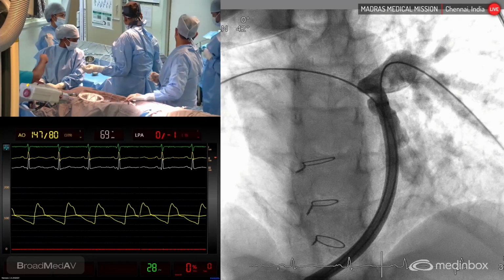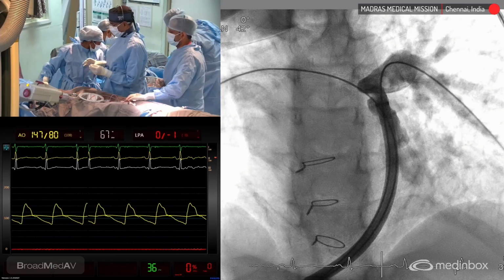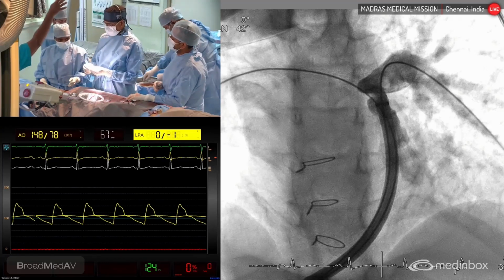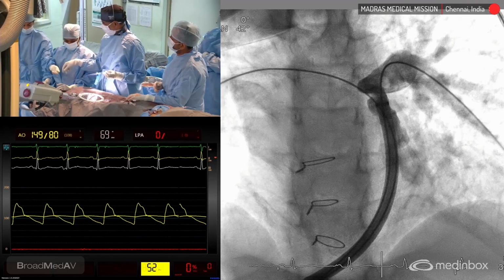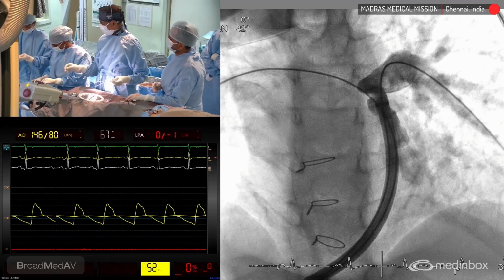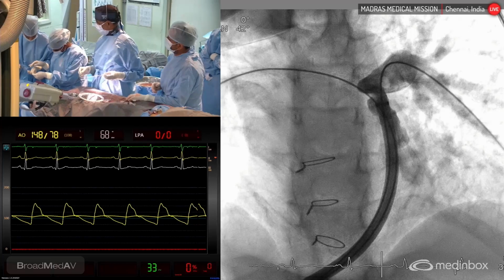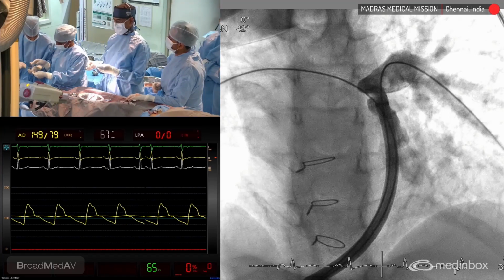we need 0.035 wires. Can we get this 0.035 thermo wire? I want that Intra Stent LD Max, 26 millimeters. Can you put it onto this wire? Not that.